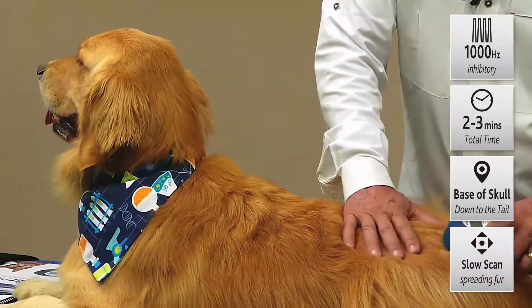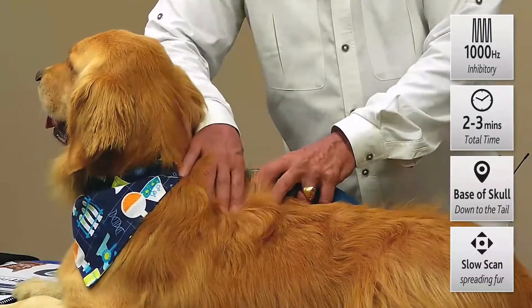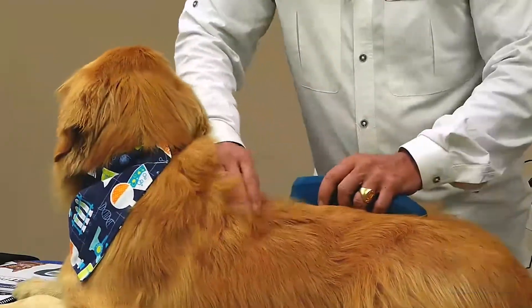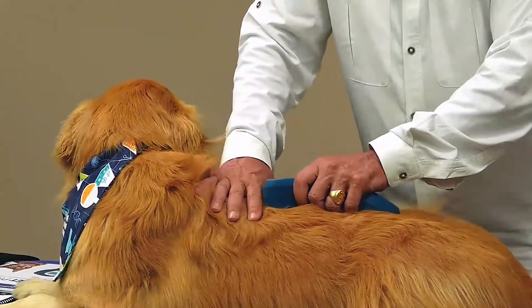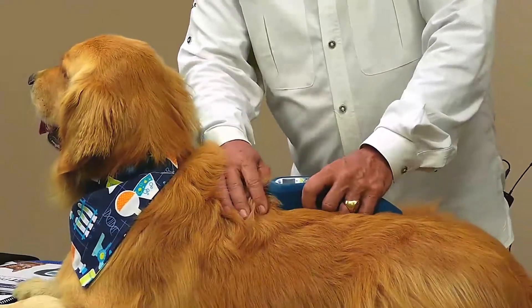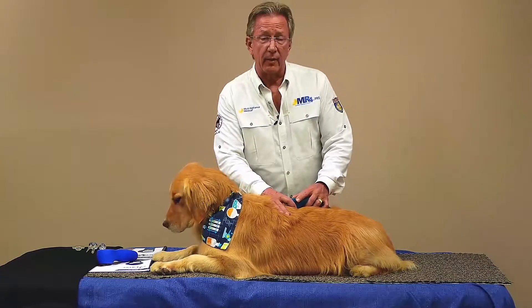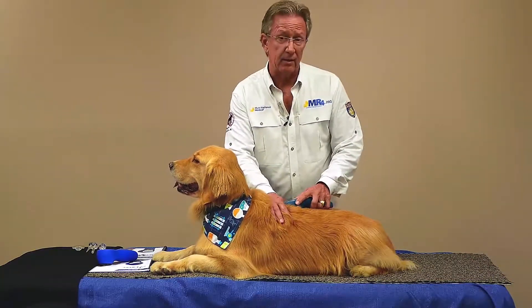You'll just go down to the tail and then come back down the other side. You're distal to the midline, sufficient for the body mass to be where those nerve roots are — where it starts to get softened and reach right into that. Just let that energy soak right into the tissues. This is so much easier than a class 4 because we have no worries about overheating tissue — I can hold it in one spot. The duration of the pulses is nanoseconds, 20 to 200 nanoseconds. No heat buildup at all.